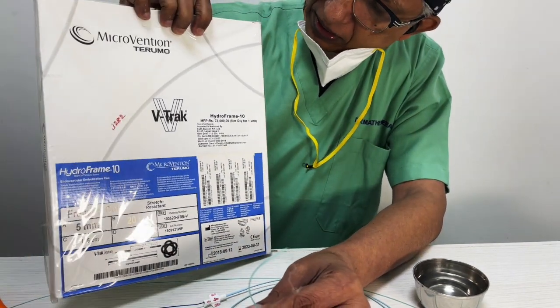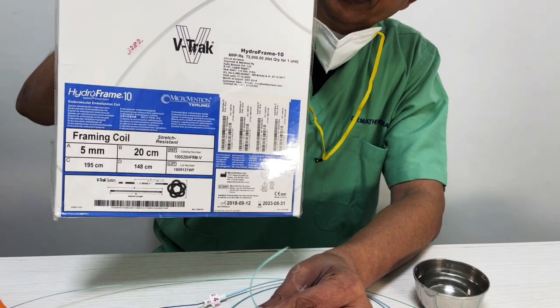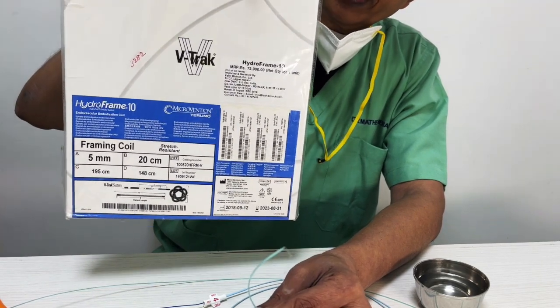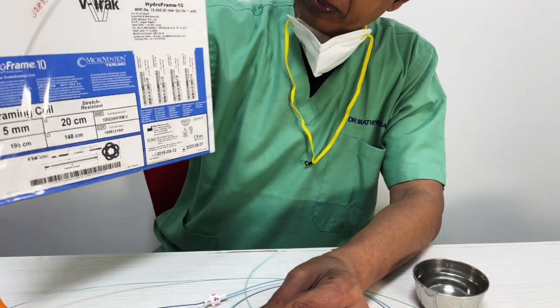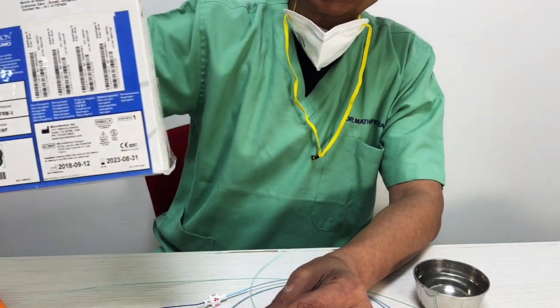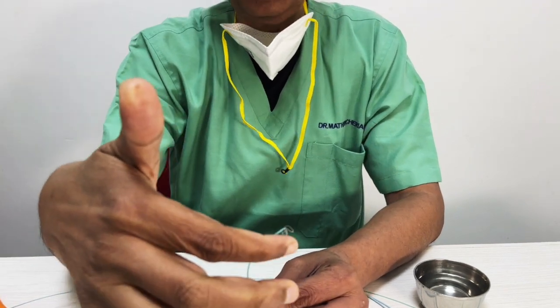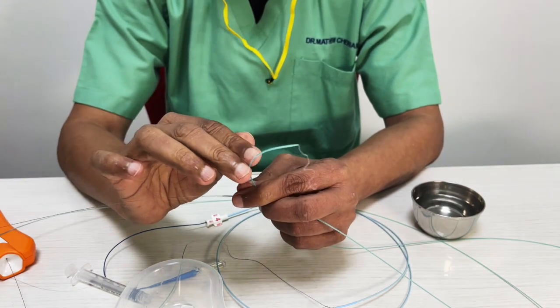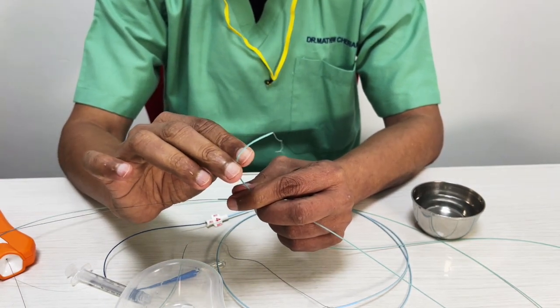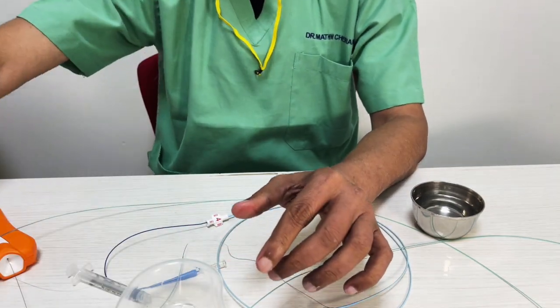This coil is called the hydro frame. So basically what it means is you can use it for framing, but it's got a hydrogel coating and it works well. The shape is a little different, but it's again another good framing coil. Okay, right. So you'll have coils that are 3D, you'll have coils that are helical. The second thing is also the property of stiffness of a coil. So I'll show you some coils, and just keep reading the box just to understand.